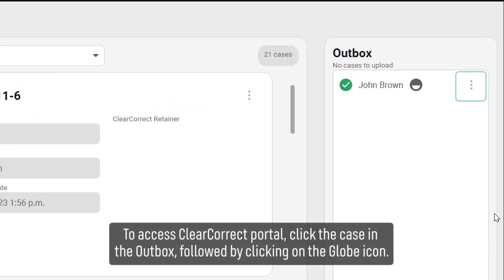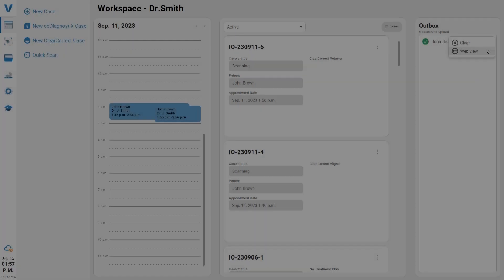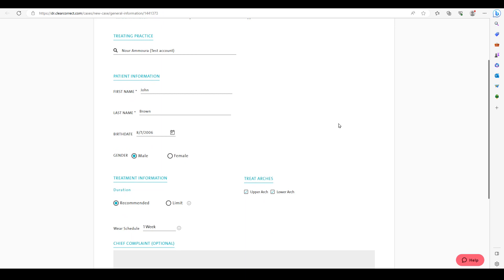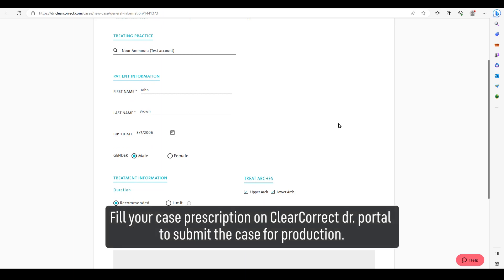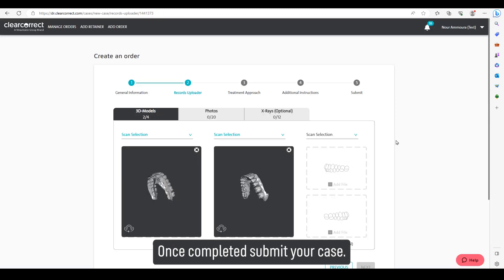To access the ClearCorrect portal, click the case in the outbox, then click the globe icon. Fill in your case prescription on the ClearCorrect Doctor Portal to submit the case for production. Once completed, submit your case.